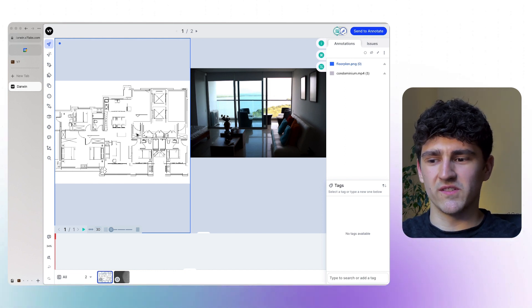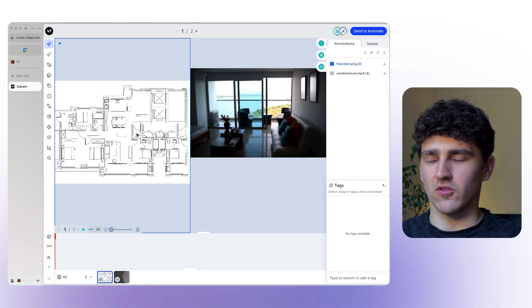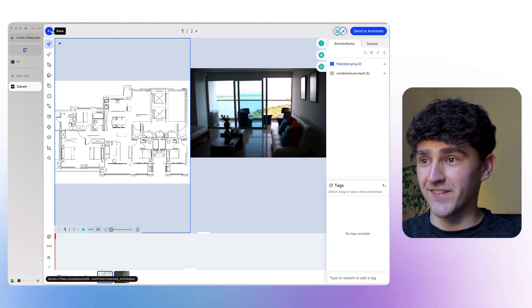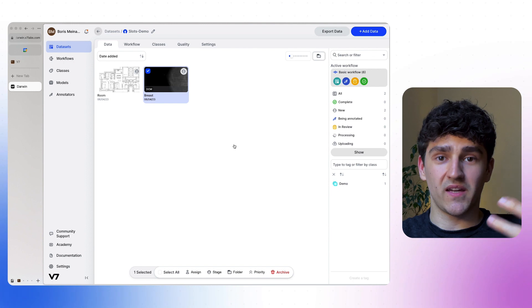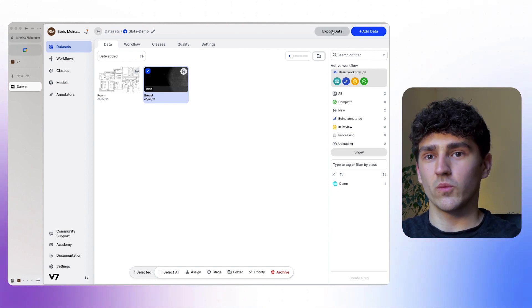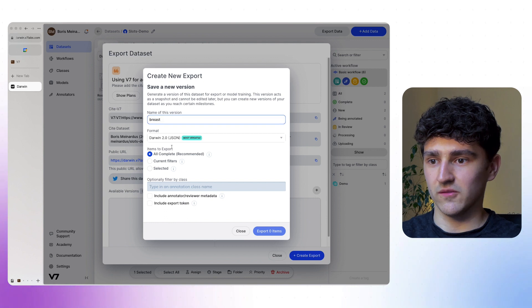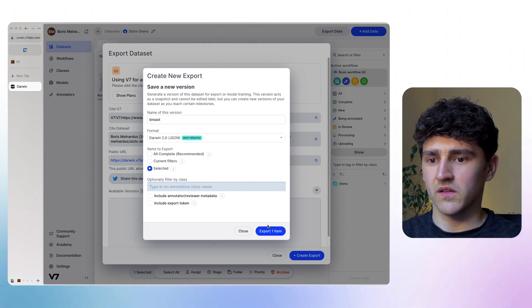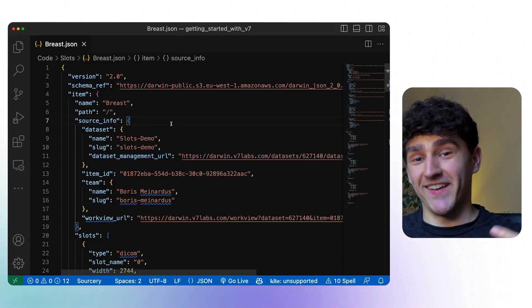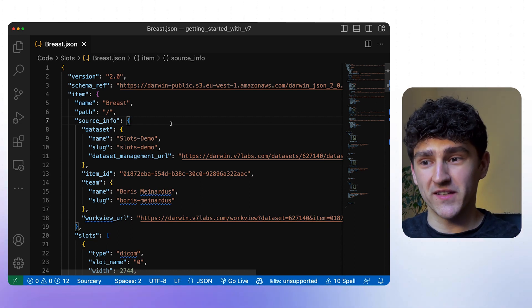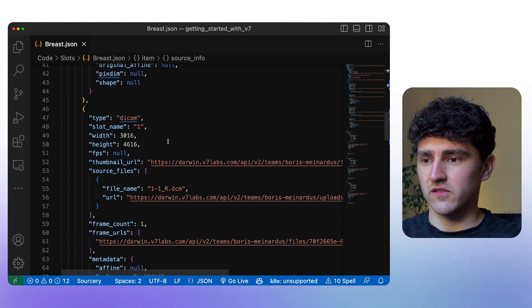But with two images in one item, how do we access the annotations done on individual slots? Let's export the breast example where annotations were made and look at the Darwin JSON annotation file. We select the file, go to export data, create a new export called breast, select the file, and export the item. We already have a full video on the Darwin JSON file format, but let's focus on how slots are represented.